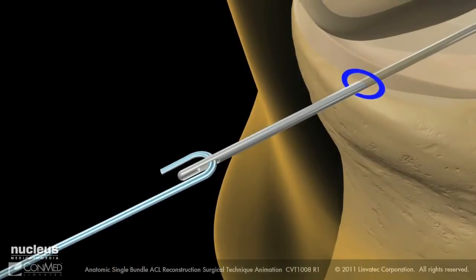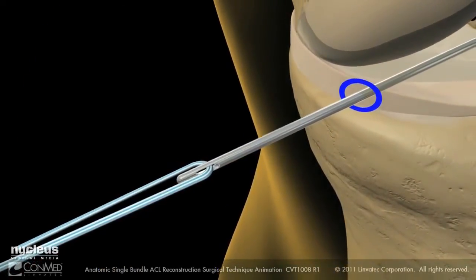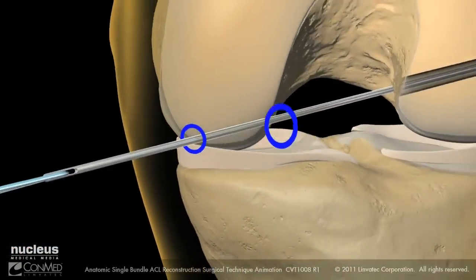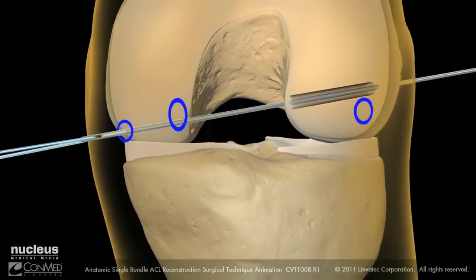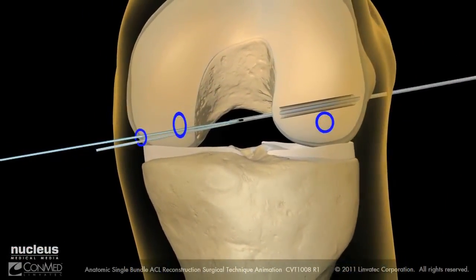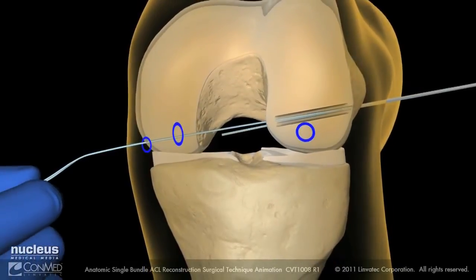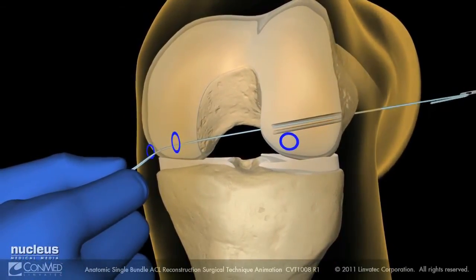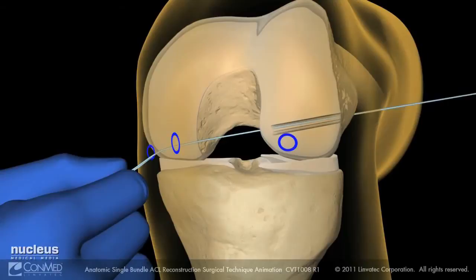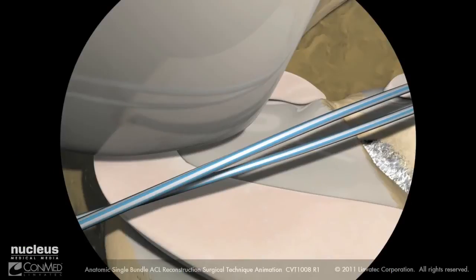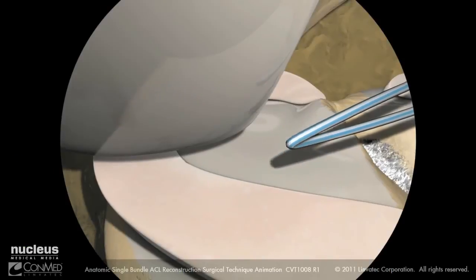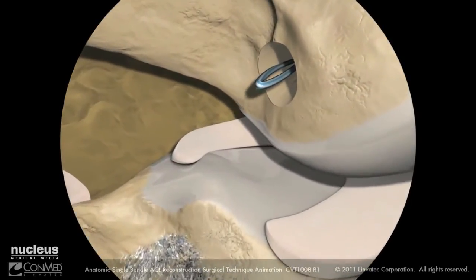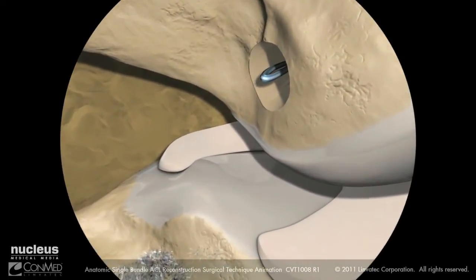Place the two free ends of the number two passing suture through the eyelet of the guide pin. Then pull the guide pin through the femur laterally, making sure to keep a finger in the suture loop to prevent it from being pulled into the knee joint. Once the suture ends are retrieved laterally, pull the looped end of the suture all the way to the entrance of the femoral tunnel.